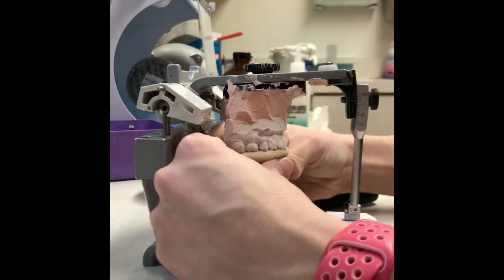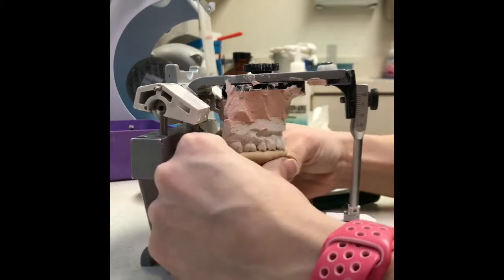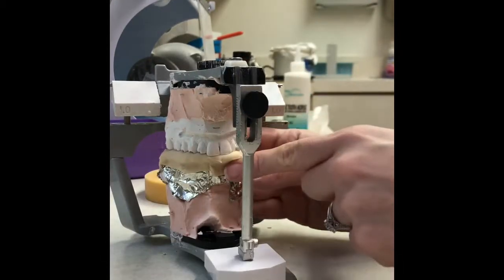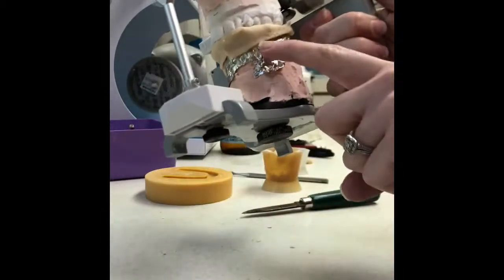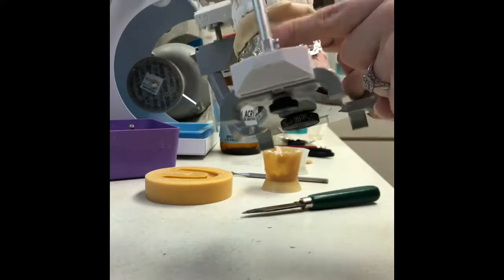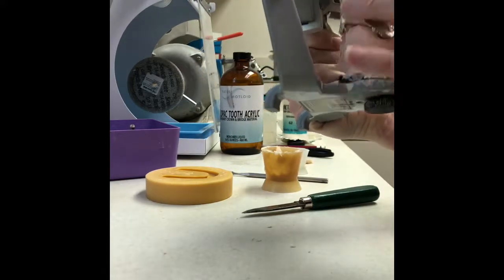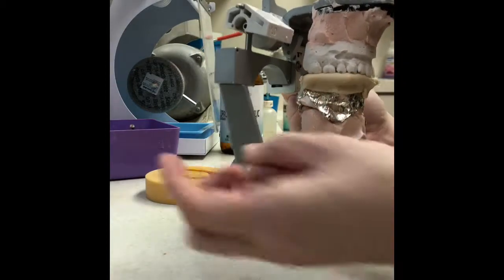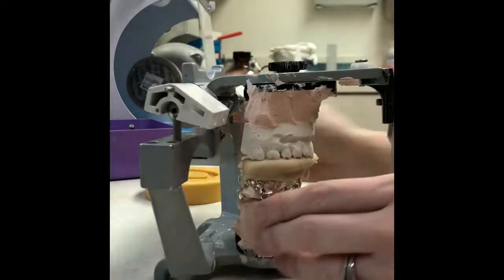you'll just need to be adapting it to the cast, making sure that the front teeth are touching, they are supported. And we go all the way around, you can see not only are those marks on the lower cast covered, but all the top teeth are touching the cast as well. We've got plenty of excess here. We could even trim a little bit more, but it's going to start to set up here.